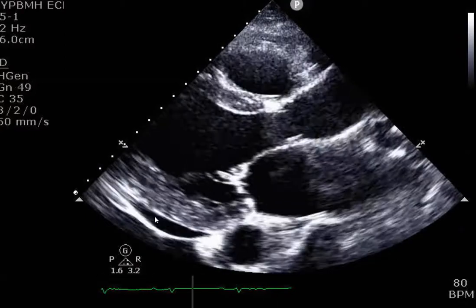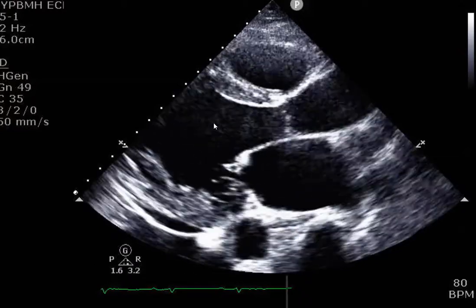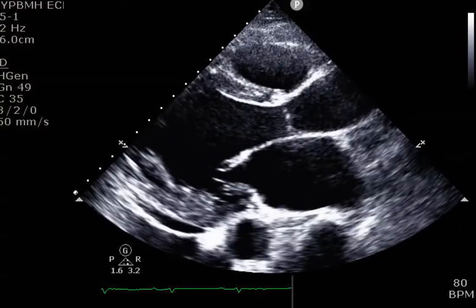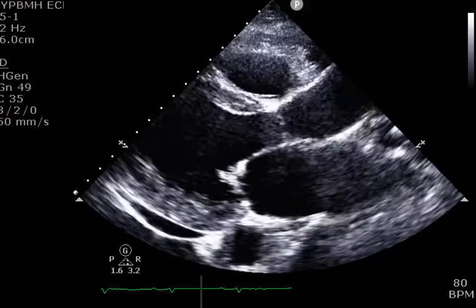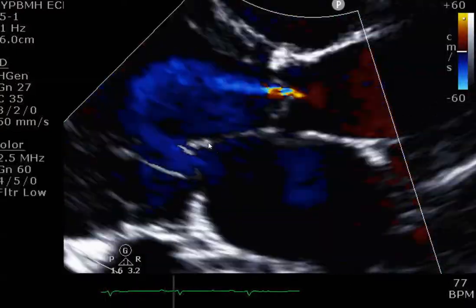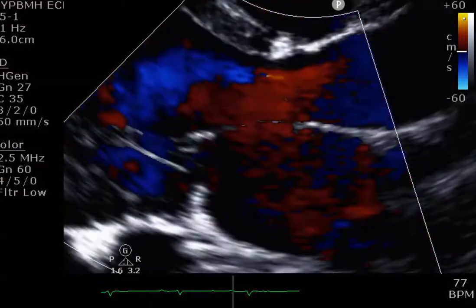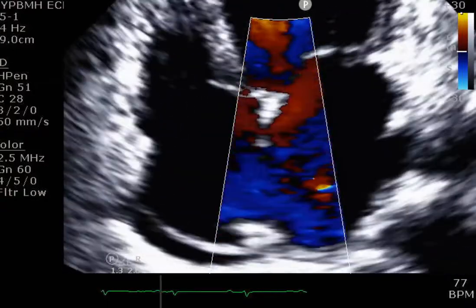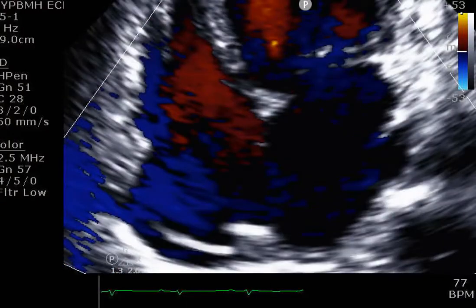None of the walls are moving very nicely, very hypocontractile, not really thickening. And I would argue that the mitral valve is not coapting well, so I would suspect that this person will have moderate, if not severe, mitral regurgitation. There is, in fact, some aortic regurgitation, and looking towards the 4-chamber view, actually having a fair amount of regurgitation. I believe I call that moderate.